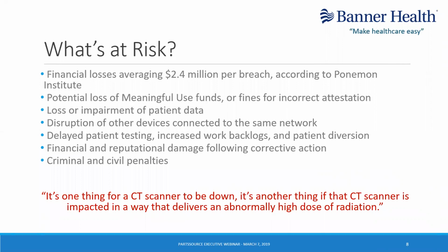Public data actually shows that it costs an average of $900,000 in HIPAA fines for each single stolen laptop. And these fines are actually increased if the OCR determines that policies and procedures are inadequate and access is not limited. So really, this drills down to how we identify what we have, how we manage what we have through defined and well-structured processes and policies and procedures, and also how we reduce risk to an acceptable level that does not cause disruption of patient care services or systems.